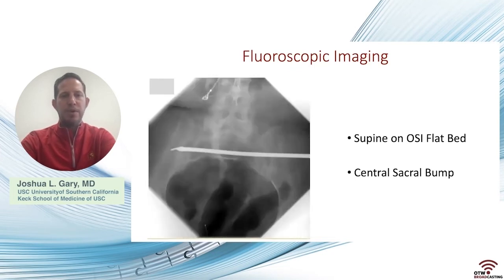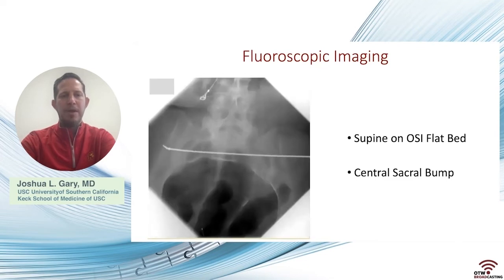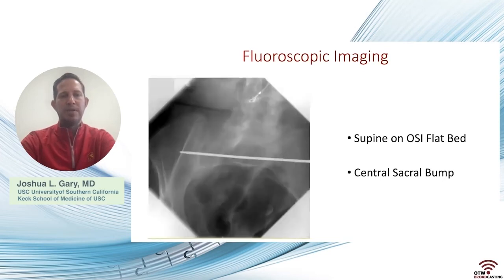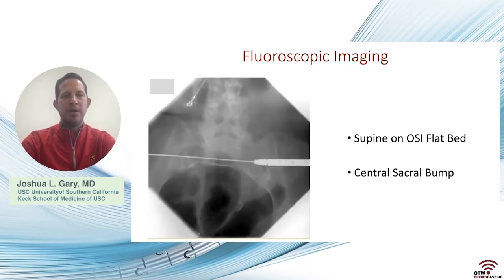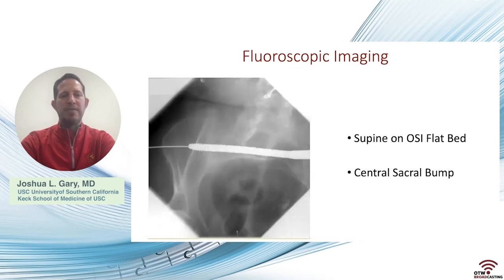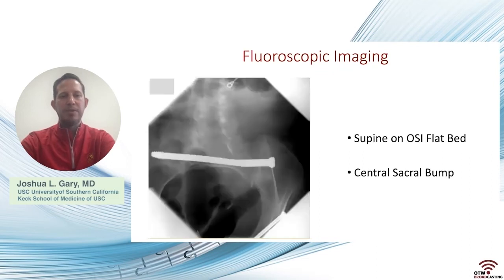And there you can see the curve on the outlet imaging. Here you can see the reamer being able to penetrate the other joint in this osteoporotic bone. And you can see us reaming now as we go across. Here we just needed to penetrate the far cortex, so we did temporarily switch to a bigger guide wire from a 7.3 set, but here comes a rod screw coming in. You can see us avoiding both of the foramina and then coming across in a transsacral transiliac fashion. And this would not have been possible with a standard screw.